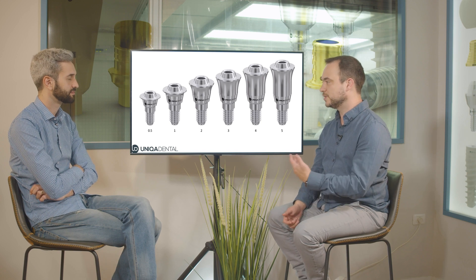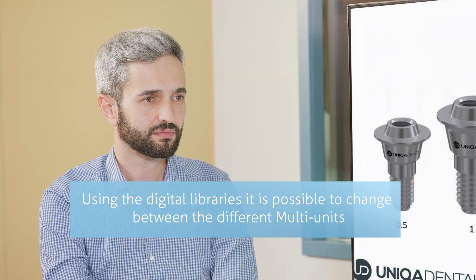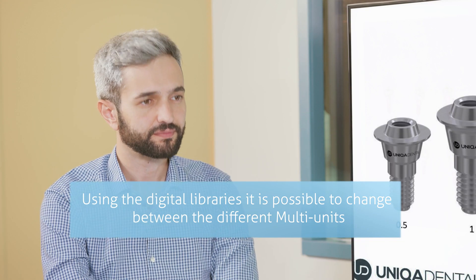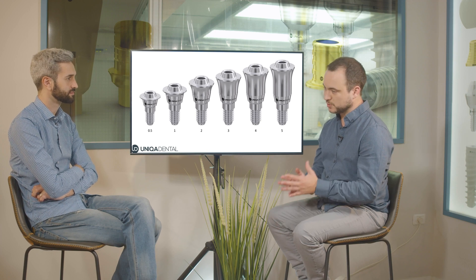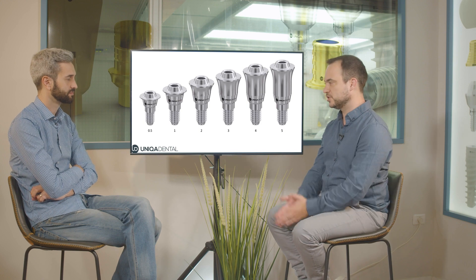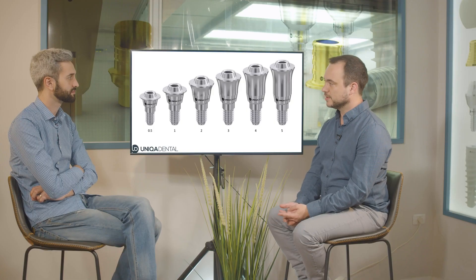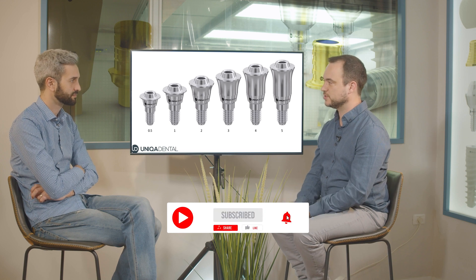Even though you take an impression on, for example, 2mm height multi-units, when you know the height you took the impression on, you can always change it to different heights in the library within the CAD program. So we took the impression from a 2mm multi-unit, changed it to a 3mm multi-unit, and then the doctor simply switches from 2mm to 3mm in the mouth and screws the bridge.